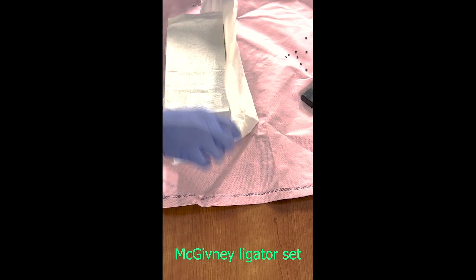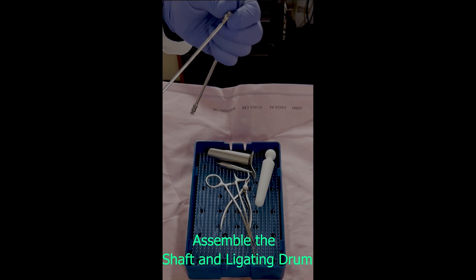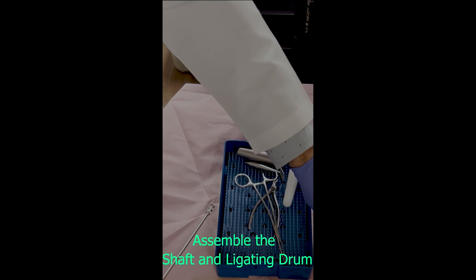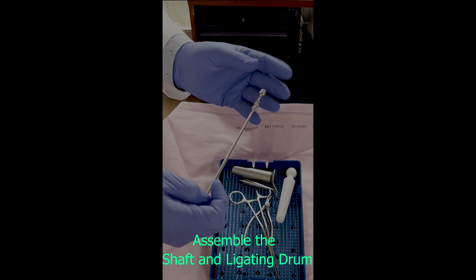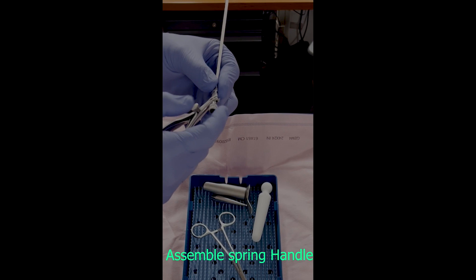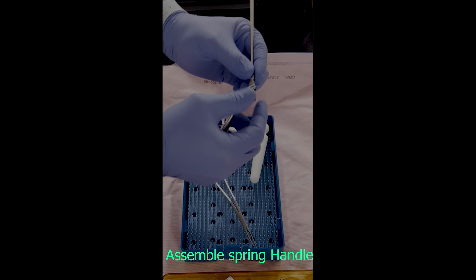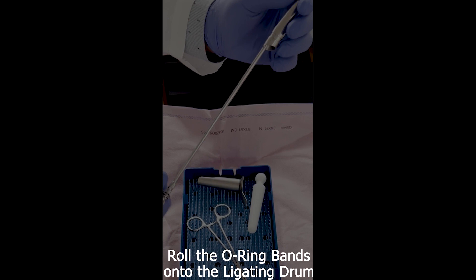The McGivney ligator set is prepared. We start by assembling the shaft and ligating drum. The spring handle is then attached. Attach the loading cone and roll the O-ring bands onto the ligating drum.